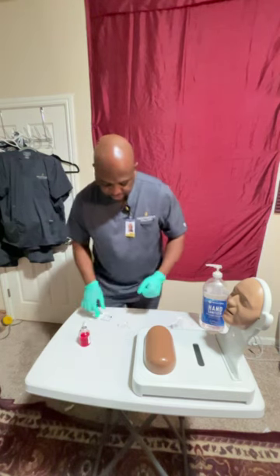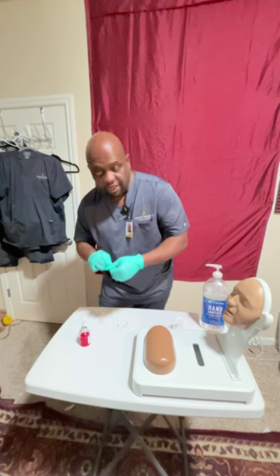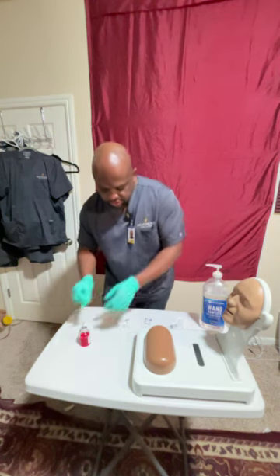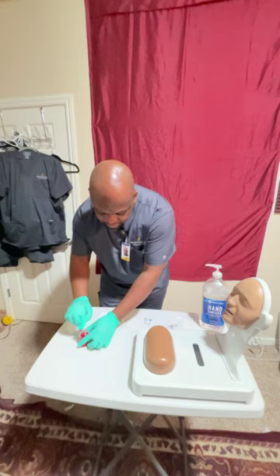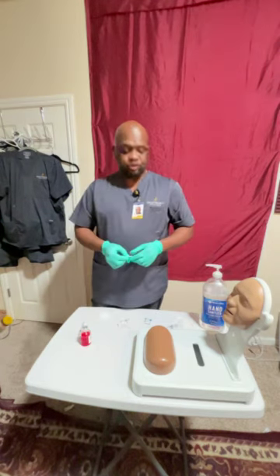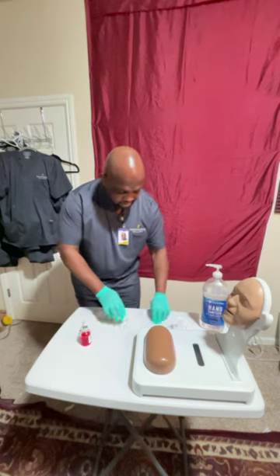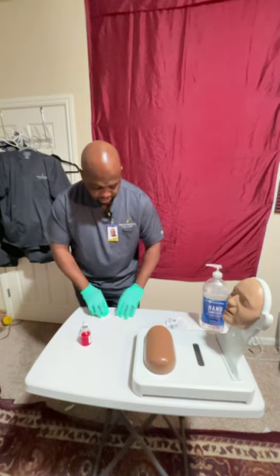Okay, now from there I am going to wipe down with my alcohol wipe the top of the medication bottle. Right, just wipe that down. Good. I'm going to let that air dry. Right, let that air dry. Let's put that there on the side.